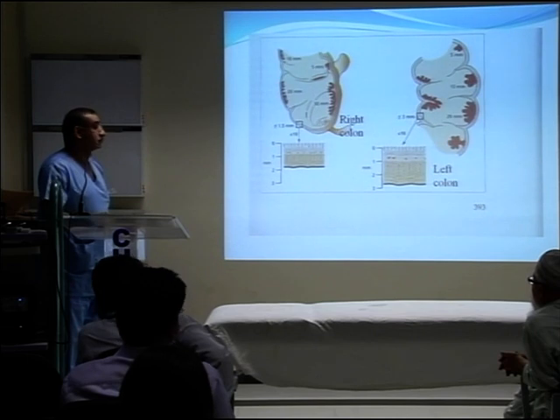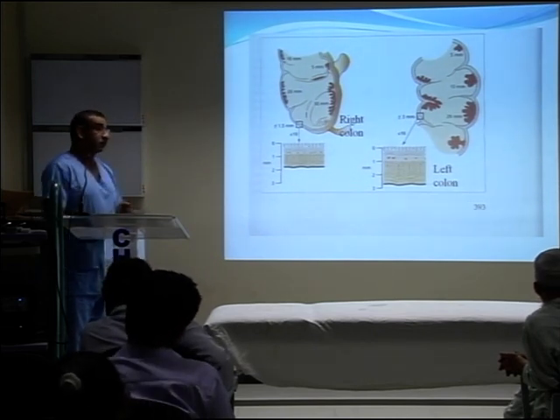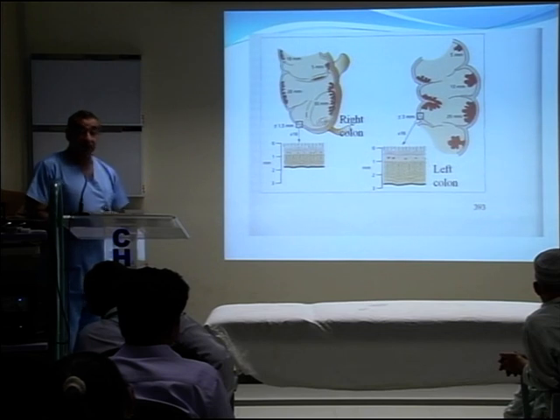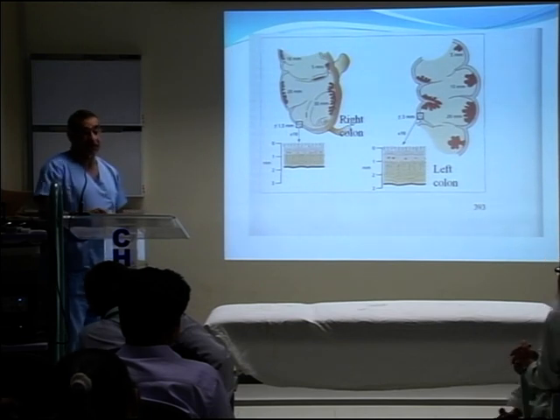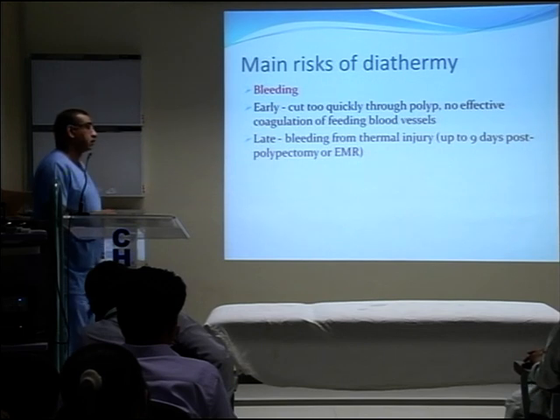I think it's very important, if you're going to use it, and I totally agree with what I was saying, to keep it completely away and just burn the tip. Mount Fujiyama kind of thing, you have ice at the top. You don't want the whole thing getting white. If you keep it really fast and just do a little burn, that's enough. You just want to burn the tip. You don't want to burn the whole.